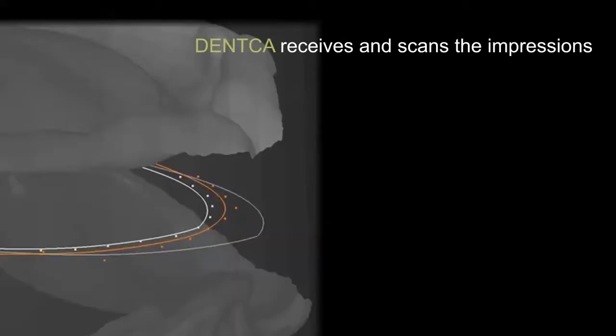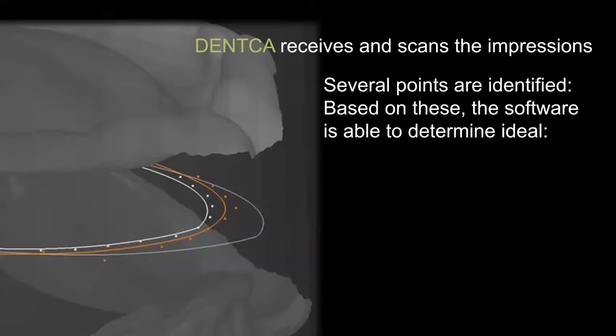Once the impressions are captured and sent to DENTCA in California, they receive them and scan them. The DENTCA software identifies several points on the impression once scanned, and based upon those points, they're able to determine the ideal functional and aesthetic situation for each individual patient.